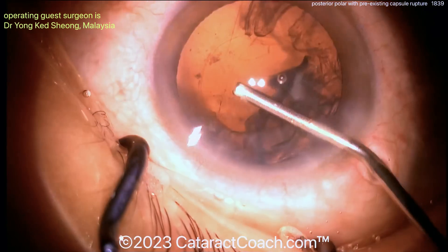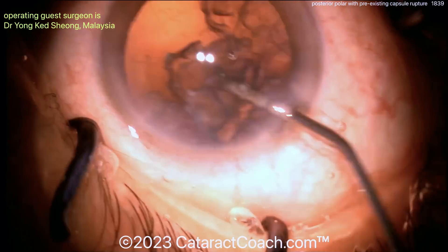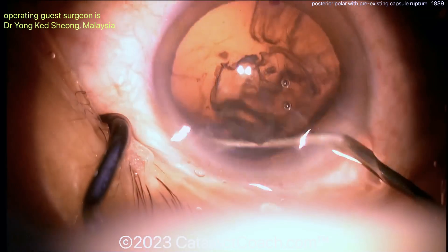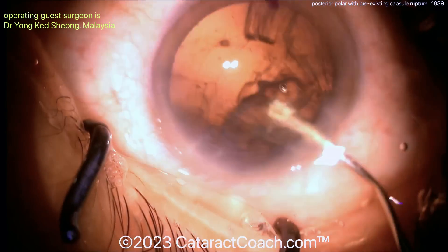Once they're up like this, you can just wash them out of the eye. Put the probe back in and emulsify them all. Even a bimanual approach for the cortex removal could be very helpful, but plenty of viscoelastic. Obviously viscoelastic is cheaper than vitreous — we all know that.